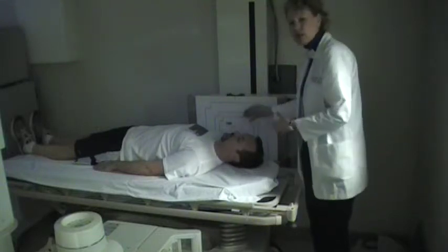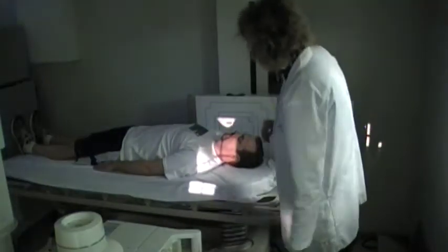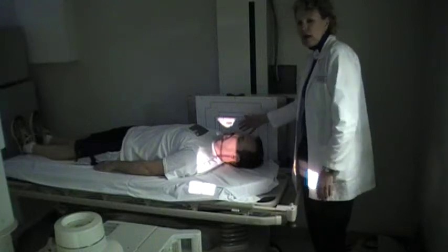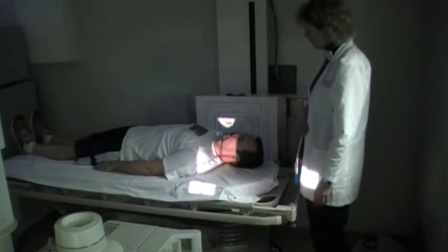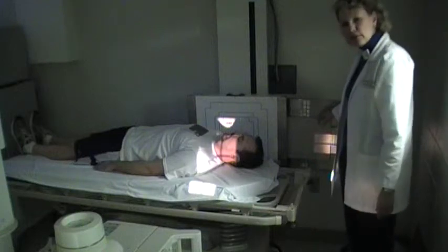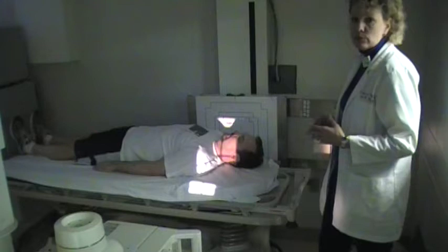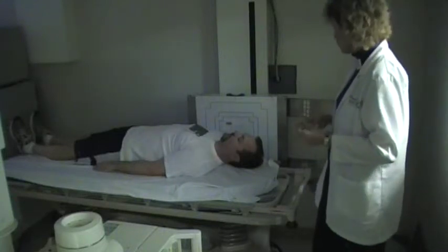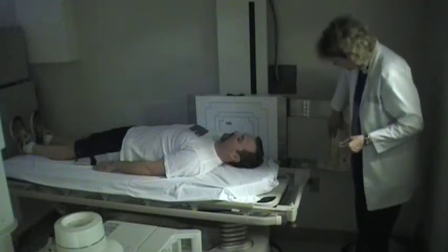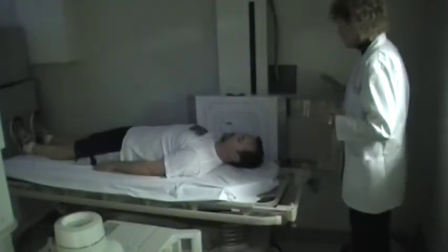You're going to have the tube at 72 inches again because you're dealing with a long object-to-image-receptor distance — since we've got several inches, you want the tube back at six feet. I'm using a 10 by 12 for the cross table cervical; you may see some places use a slightly larger image receptor, but typically 10 by 12 is all I ever use. Place your image receptor so that the length of it goes with the length of the neck.